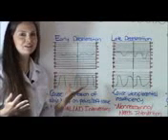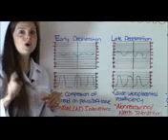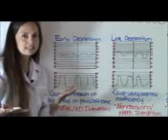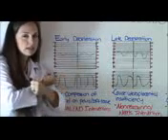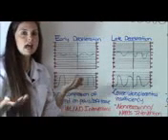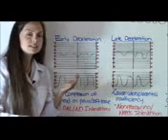Back to early decelerations. Out of all the three types, early decelerations is what is normal. There is no interventions required. You're going to expect to see this when a woman's in labor. The woman's having contractions, and whenever she's contracting, the uterus is squeezing that baby, and the baby's being compressed up against the pelvis or the soft tissue like the cervix. And whenever that happens, that just causes the fetal heart rate to dip just a little bit.